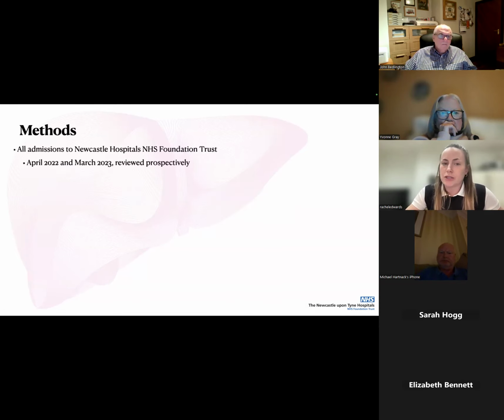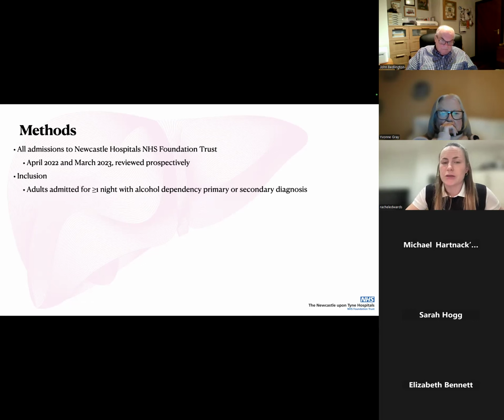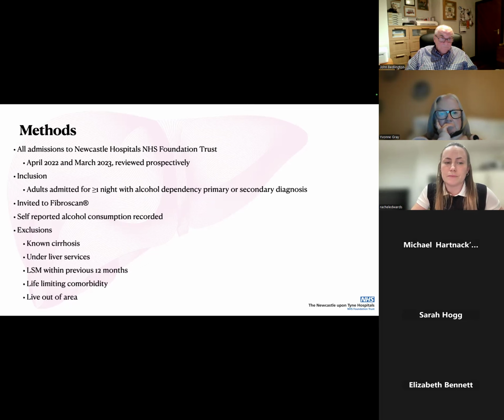So all admissions to Newcastle Hospitals NHS Foundation Trust were reviewed prospectively over a 1-year period, spanning from April 2022 to March 23. And we included adult patients who were admitted for 1 night or more with alcohol dependency, coded for as either their primary or secondary diagnosis. We invited all of them to attend Fibroscan, and we also recorded their self-reported alcohol consumption.